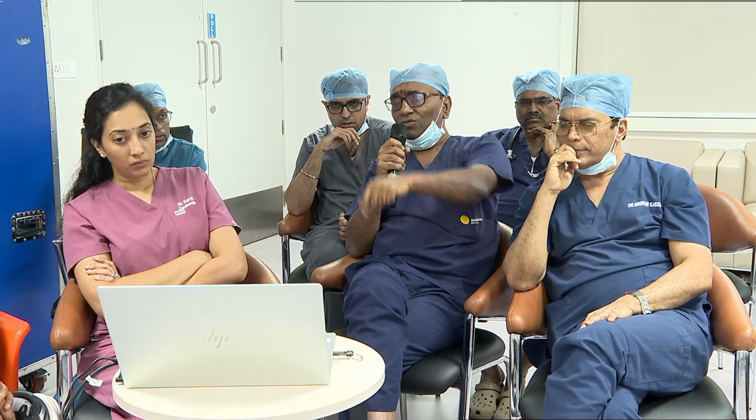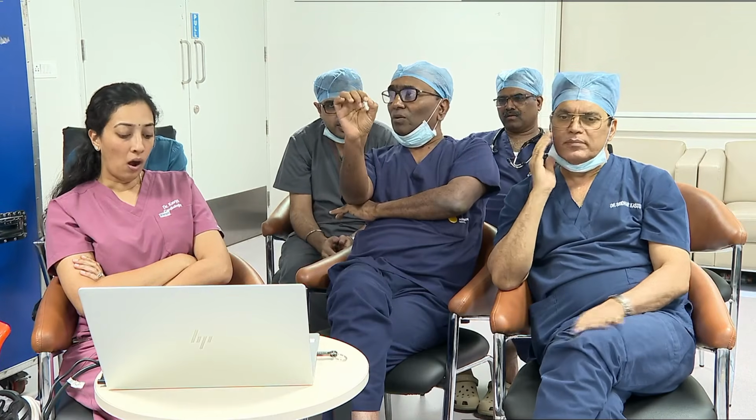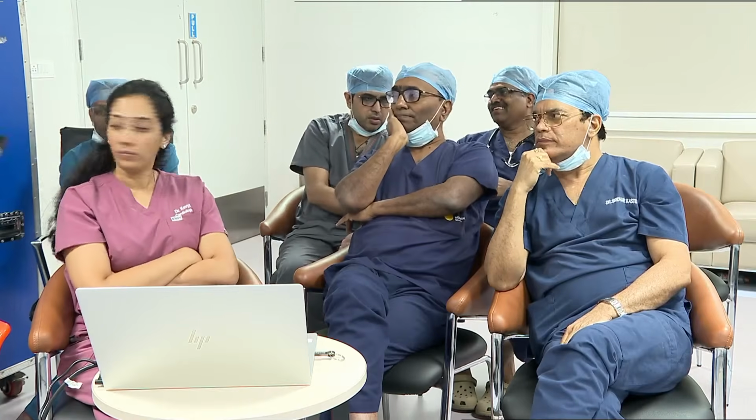In this case we have used peripheral IVL. How does it differ from the normal coronary IVL? That is point number one. Point number two: what are the predictors of conduction disturbances in TAVI, in the ECG or during technical things during the procedure? Difference between peripheral IVL and coronary IVL, and predictors of conduction disturbances pre and during TAVI.